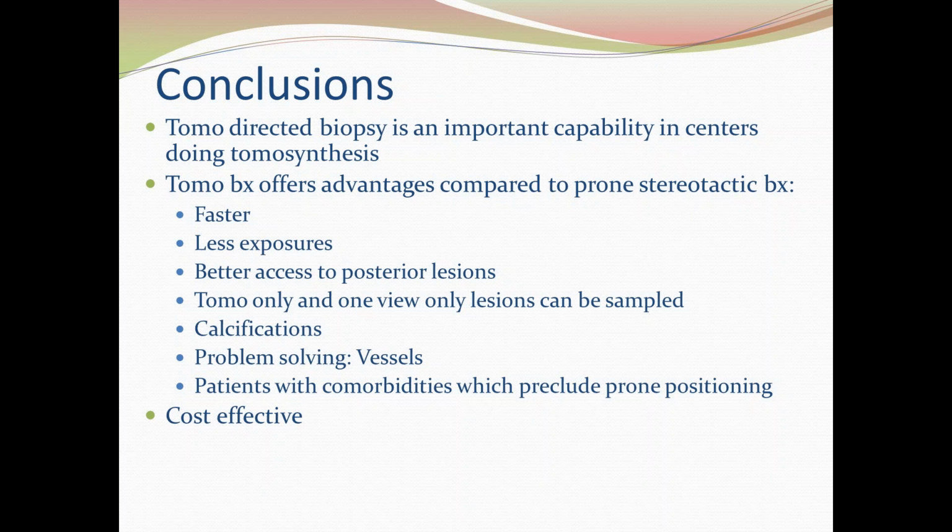And some are frankly more comfortable lying down. Some of our handicapped patients and mentally disabled patients may be better to be done on the prone table because they don't see the biopsy devices. And finally, it can be very cost effective because you don't have a whole room and piece of equipment dedicated to doing biopsy. And even in the busiest centers, and we have a very busy center, we don't use our stereo machine all the time. So that piece of real estate within our breast center is unoccupied for a significant period of time.